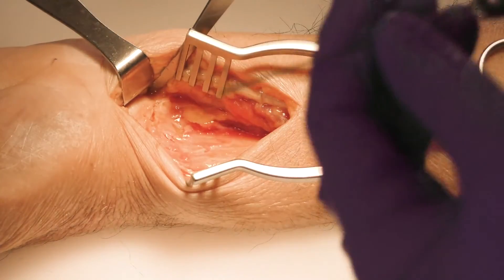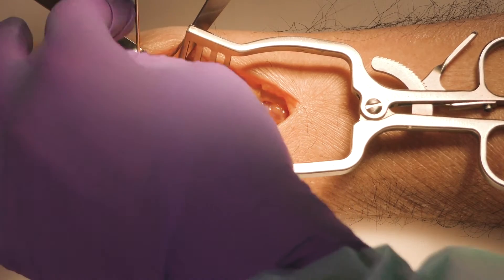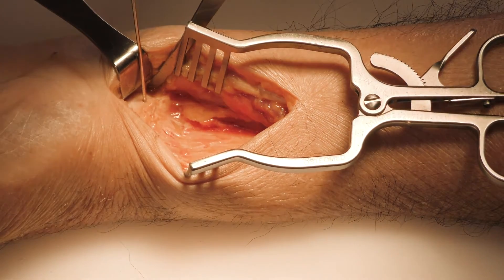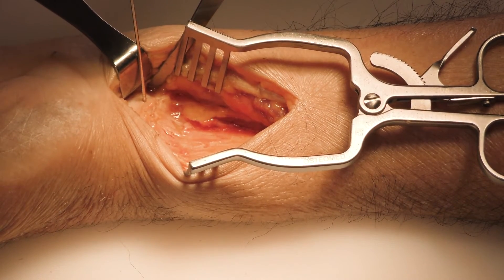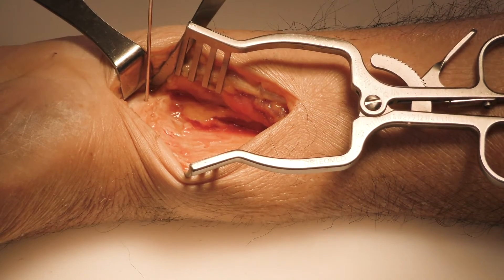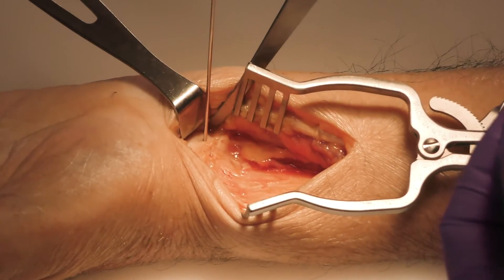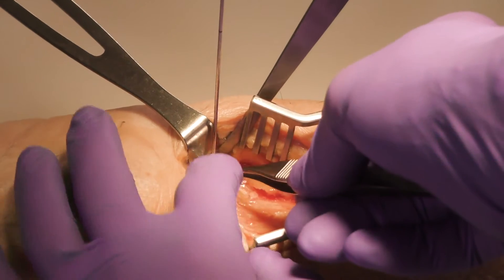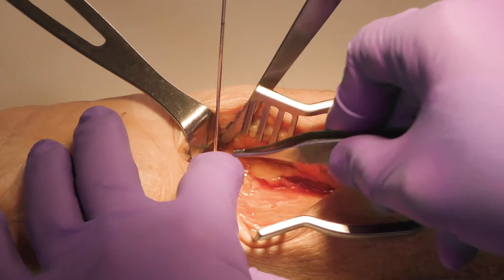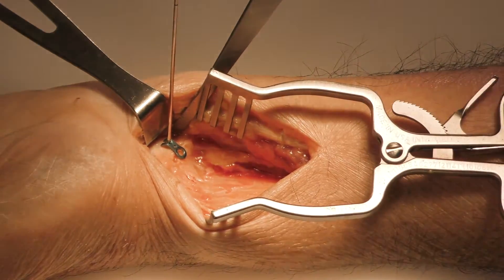What I typically like to do is identify that fracture fragment and provisionally fix it with a 0.054 K-wire. Your surgeon will identify the volar lip of the distal radius, insert the K-wire using it as a joystick, reducing the fracture and passing the wire bicortically to secure that fracture fragment first. From here you can place your avulsion hook plate with the tines set onto the 0.054 K-wire to act as a stabilizer when you secure the hook plate to bone and the distal radius plate to bone.